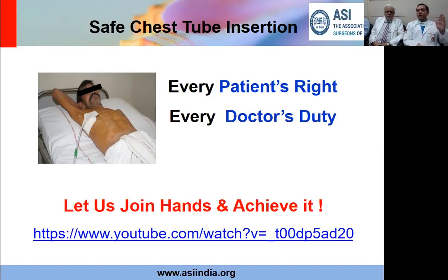So therefore, if any patient has been aspirated once and has reaccumulated and is again having fluid, I would go for a chest tube insertion, complete drainage, and keep the tube there for a few days. One time, single, careful chest tube insertion, done properly, is safer than the risks associated with multiple aspirations being done. I hope I answered.